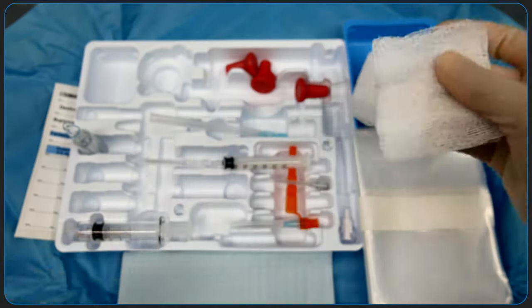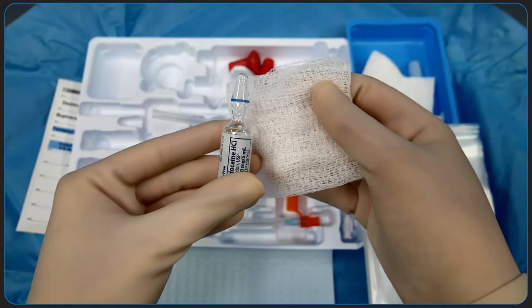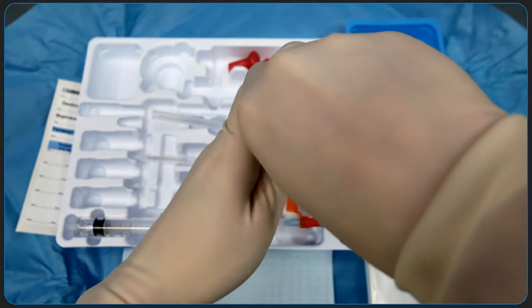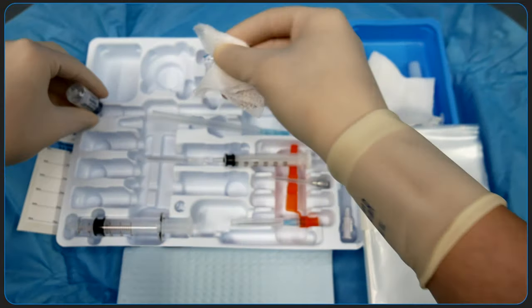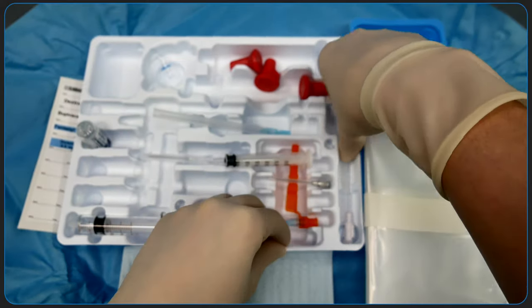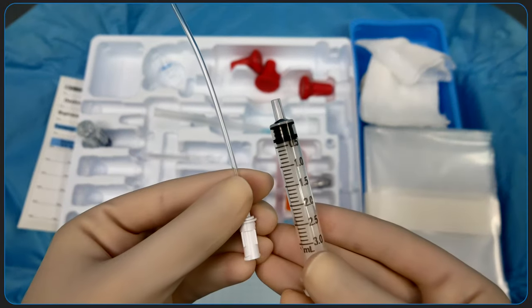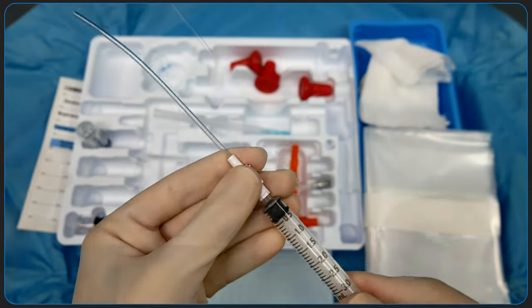To open the vial, you can elect to use gauze to give yourself a bit of protection. Use one hand to secure the vial, and the other to push the top away from you. This breaks open the vial and minimizes the chances of cutting yourself. Use the filter straw to draw up the medications. You will do this for the 1% lidocaine as well as the spinal anesthetic.